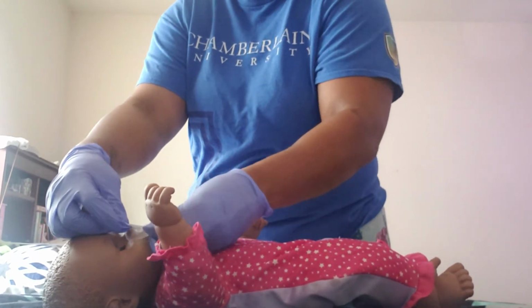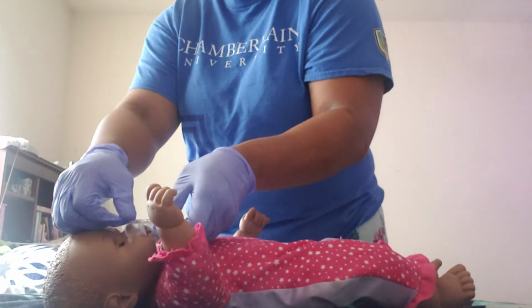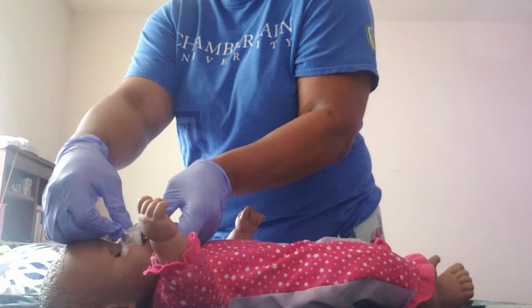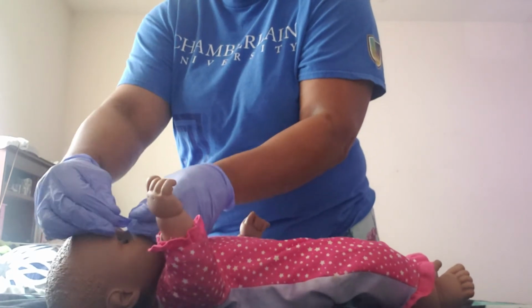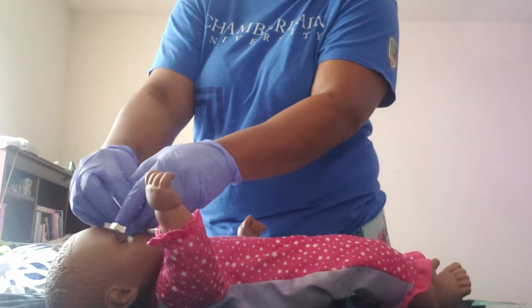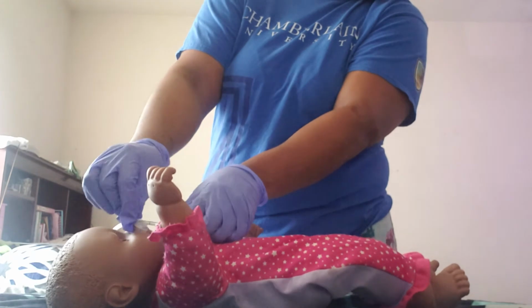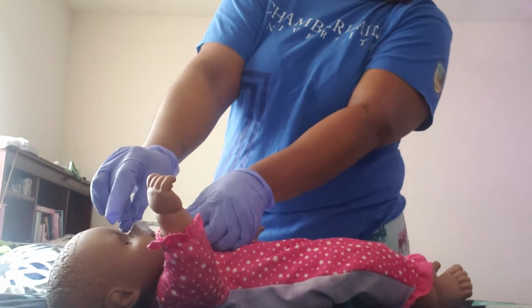Kind of hard doing it with gloves on here, but wrap it around. There we go. And secure it with the tape.